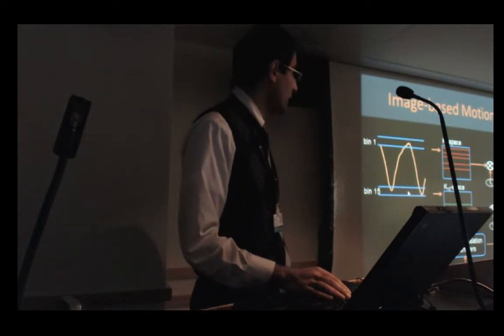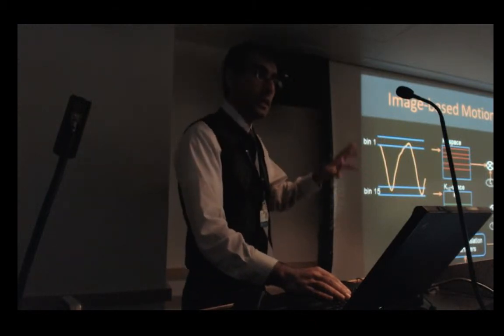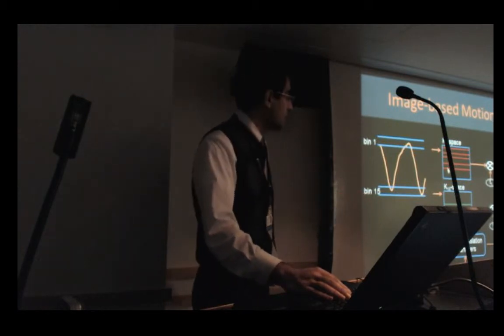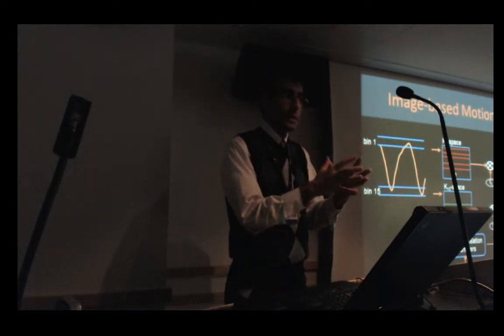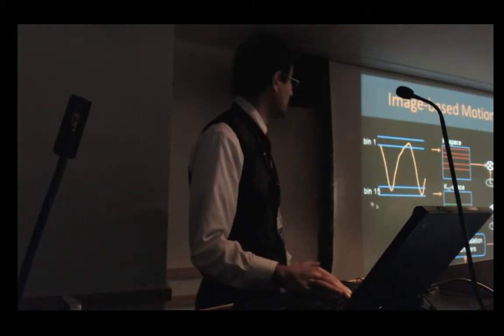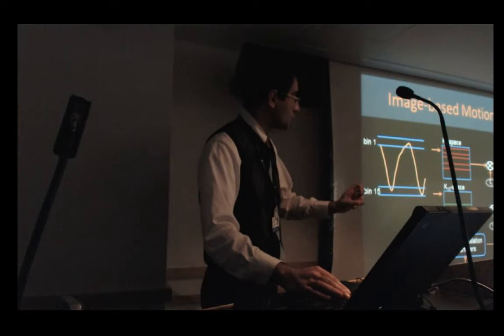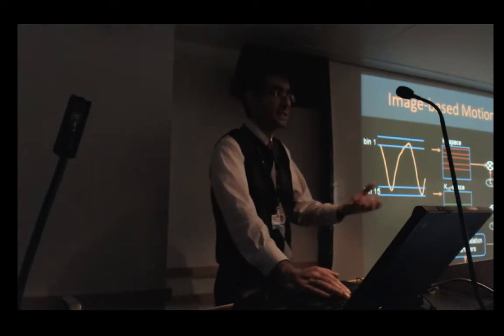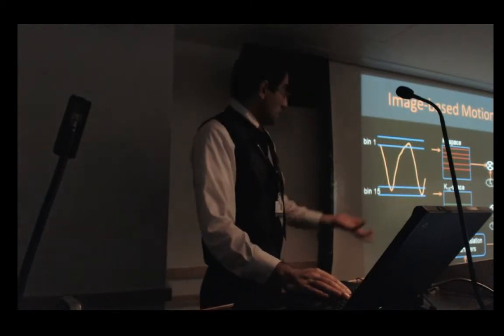So one way to correct the K-space lines is to bin the respiratory motion. If I have the respiratory pattern, I can have, for example, 15 bins. Let's say we have 15 bins. Bin number one looks at the K-space lines acquired at end expiration, and we go through to bin number 15, K-space lines that are acquired at the beginning of inspiration. Then I would have 15 K-spaces. Each of those K-spaces is randomly sampled due to the respiratory motion.